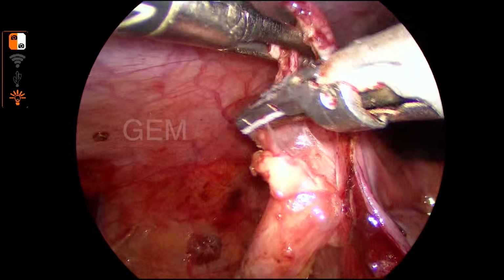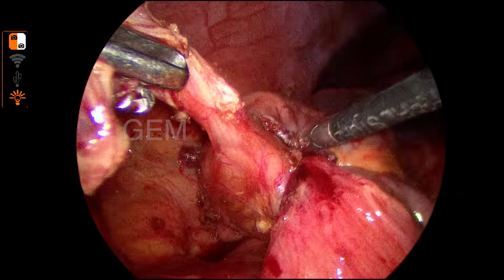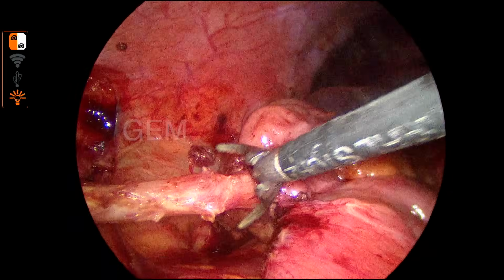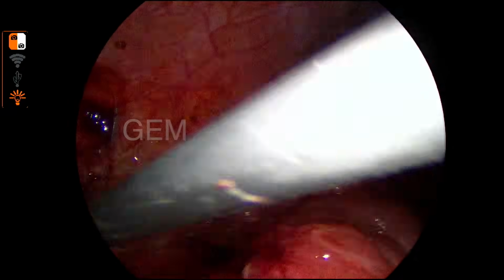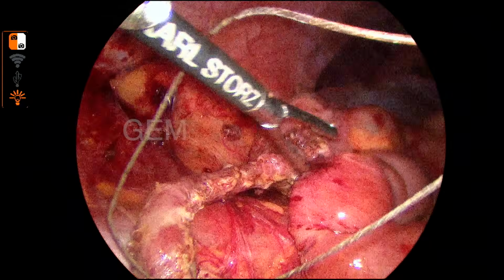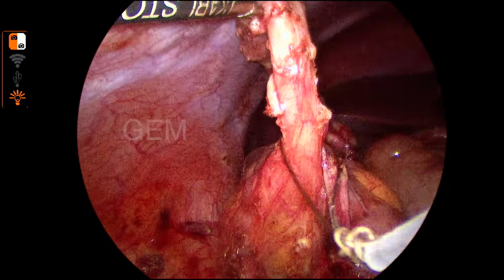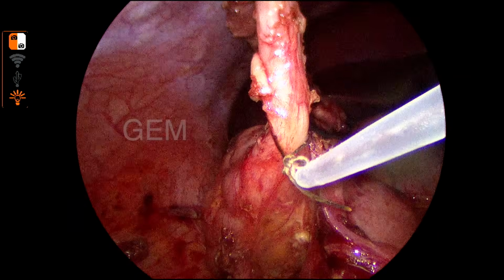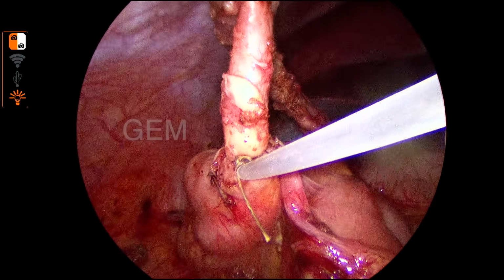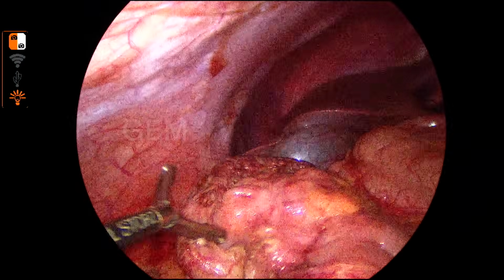I was able to see the tinea coli. In some cases, we can see all three tinea coli merging. In a retrocecal appendix, we mobilize the cecum, and then you are able to see all three tinea coli. So now it's very clear we have not injured the base of the cecum or the ileum. We mobilize the ileocecal junction, the cecum and the ascending colon. And after mobilization, we were able to find the inflamed appendix. It's a rolled, inflamed appendix, and we mobilize the appendix.